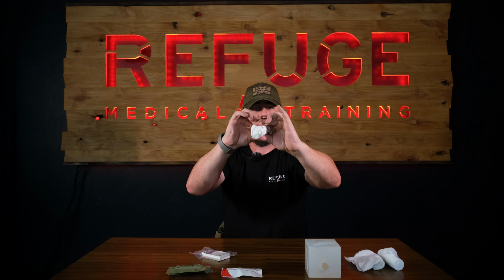Once it comes out, it's compressed into a little brick, even though this is a roll of gauze, okay? This one is Z-fold, we'll get to that in a second, but this is a roll of gauze. So I'm going to bend and flex this around in order to fluff it up essentially. See how it's kind of fluffing up there? I find the end of it here and I pull this out. Now you can see the difference in the thickness of these two gauze, right? Pretty easily. This is going to be much more difficult to pack into a small wound like that.